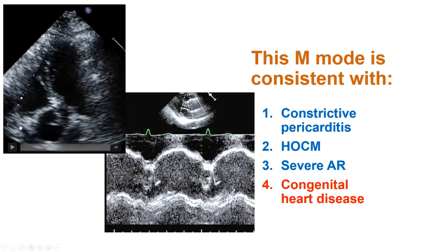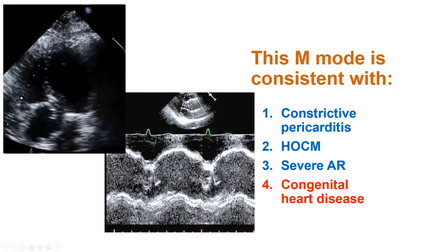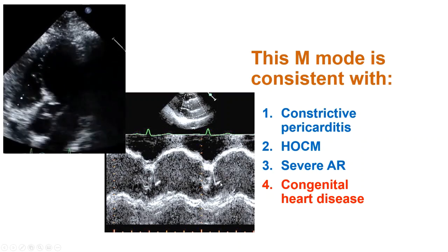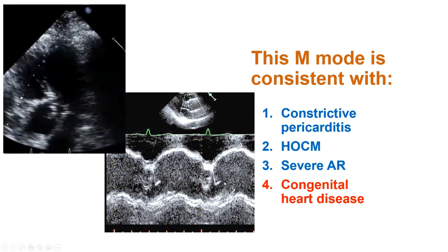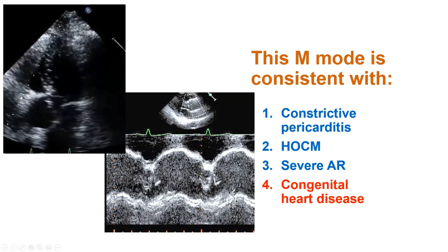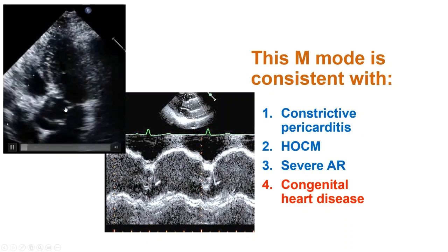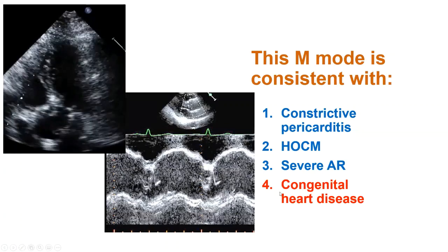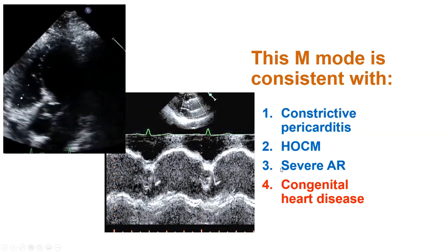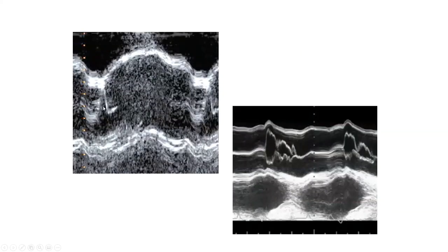Here's another M-mode: a two-dimensional echocardiogram with a specific aortic valve envelope. The answer here is congenital heart disease — this is the aortic valve envelope seen with a fixed subvalvular membrane (subaortic membrane). This is to be contrasted with dynamic outflow tract obstruction as seen in HCM. With the subaortic membrane, the opening and closing tends to be very early, before the main aortic valve envelope, whereas with dynamic obstruction the closure is in the mid-portion of systole.